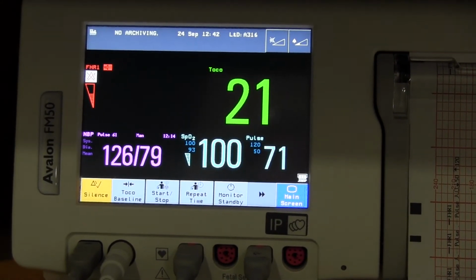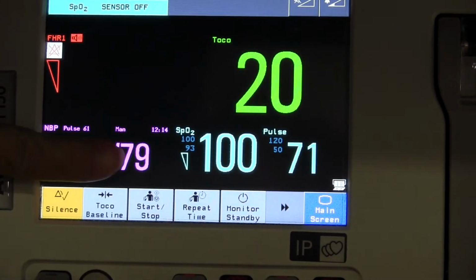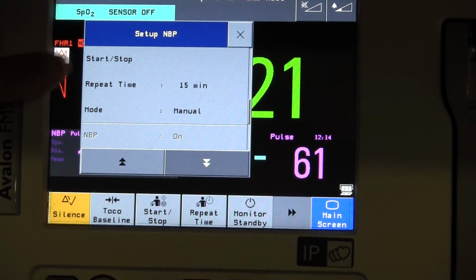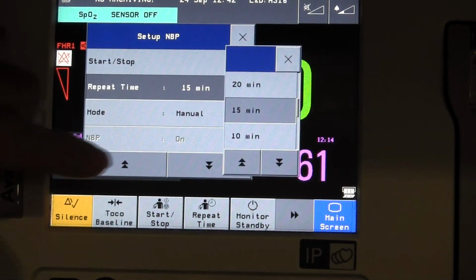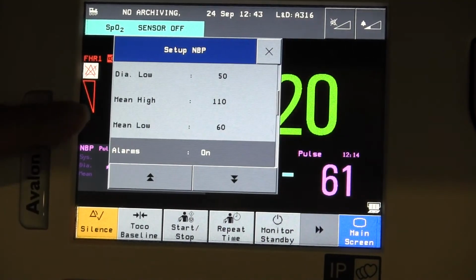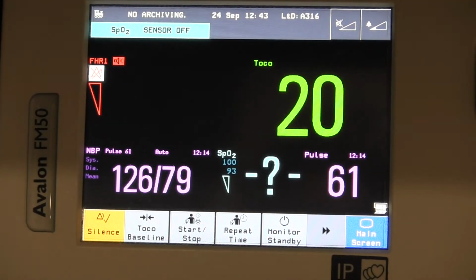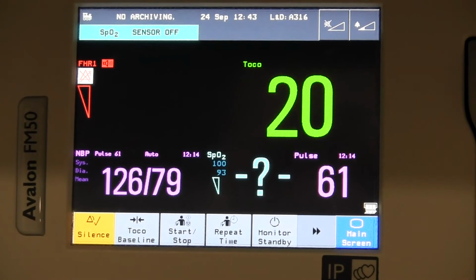If you need to do blood pressures automatically at a set interval, touch the screen where the blood pressure value is displayed. Scroll down until you see Repeat Time. By touching that part of the screen, you can choose the time interval that you would like. Then, right below that, switch the mode from manual to auto. Close your screen. Hit the Start-Stop Blood Pressure smart key to begin monitoring blood pressures at the chosen interval.